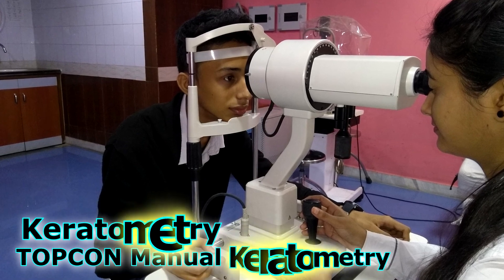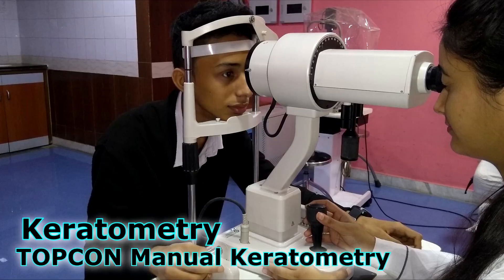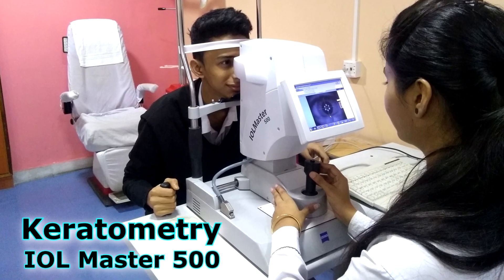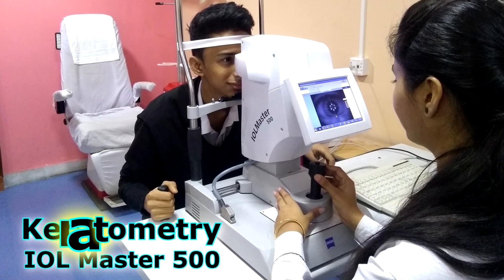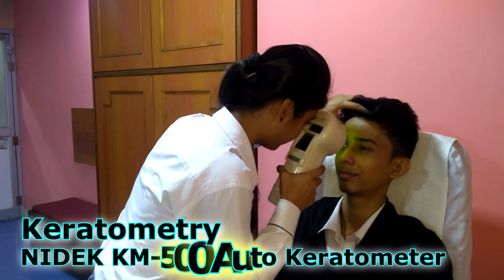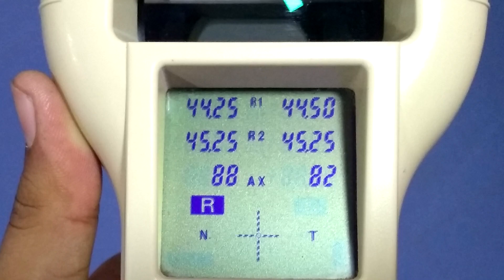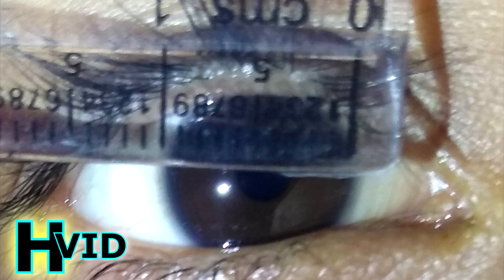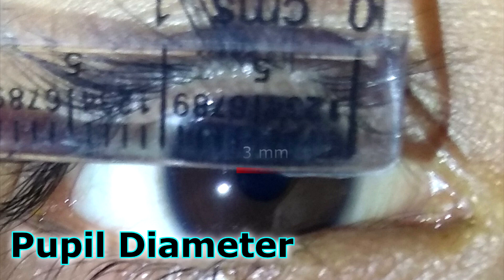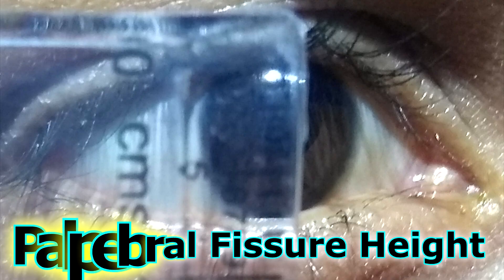To measure corneal curvature and determine the K1 and K2 values, we can use various types of keratometers such as manual keratometers or automatic keratometers. In this video we are using an automatic handheld keratometer by Nidek. Here are the values we got. We should also check the horizontal visible iris diameter and pupil diameter using a ruler.